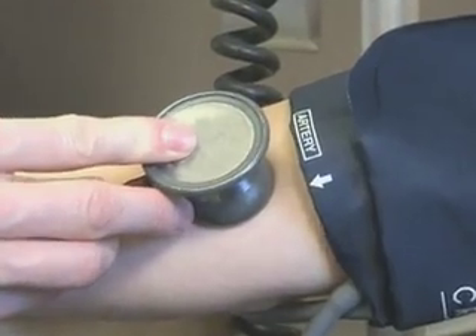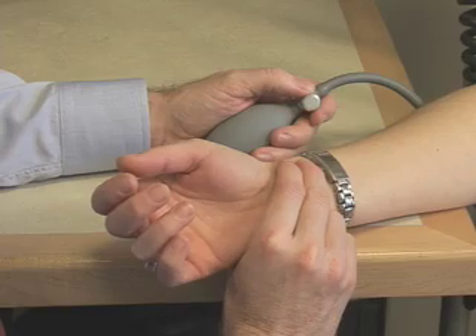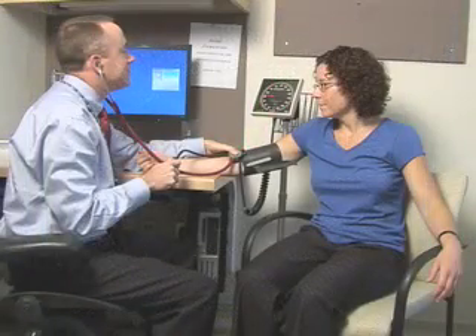Measuring blood pressure correctly is required to classify individuals, to stratify their cardiovascular risk, and to monitor the effects of treatment. This video provides the viewer with a standardized methodology that, when followed, will lead to accurate blood pressure measurement.